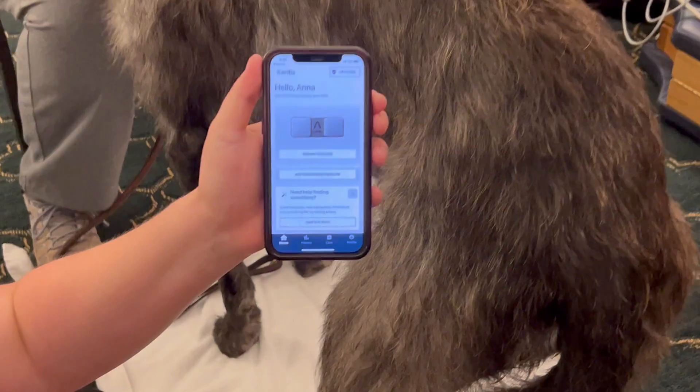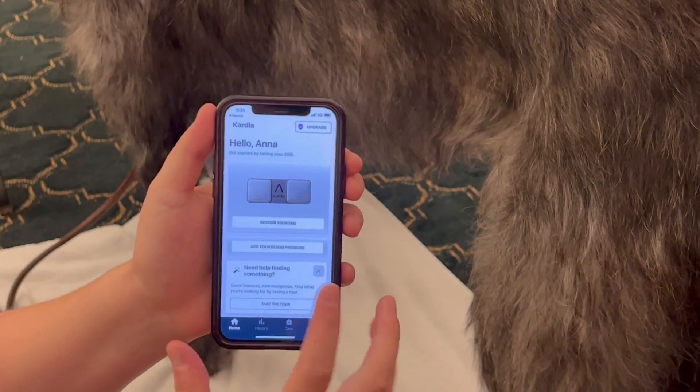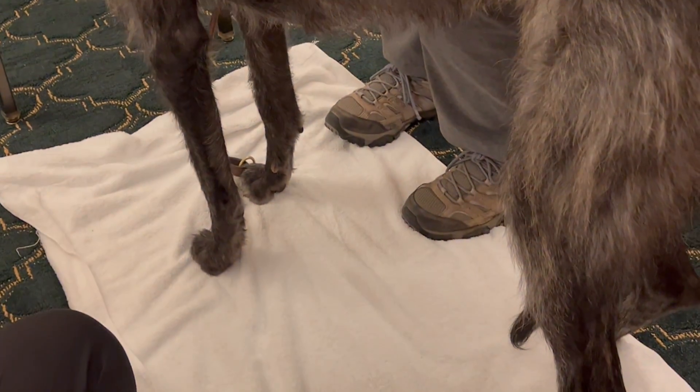Open that application and it'll welcome you to the page, then bring up the screen that says 'Record your EKG.' You need to tap that before getting started, but I'm going to take a second and take the device out of the box.